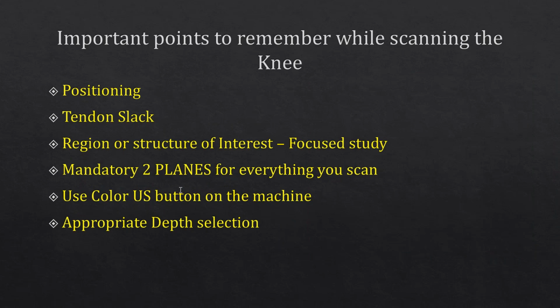Questions? Okay, I see one question. So first question is, what would the protocol be for a drop foot suspected from knee? Okay, good question. So if I had this patient, I would do EMG and ultrasound both for this patient, because the drop foot could be from stenosis, peroneal neuropathy, sciatic neuropathy, peroneal neuropathy at the fibular head. First, do the EMG, and then follow that up with ultrasound of peroneal nerve around the fibular head.